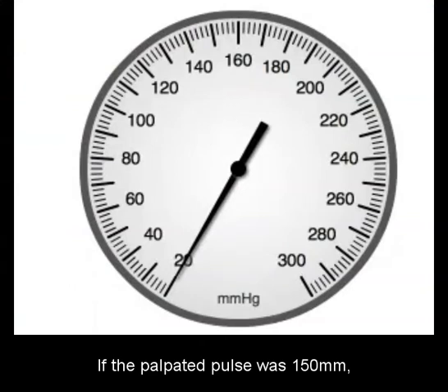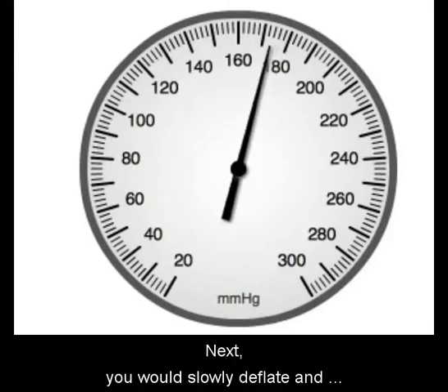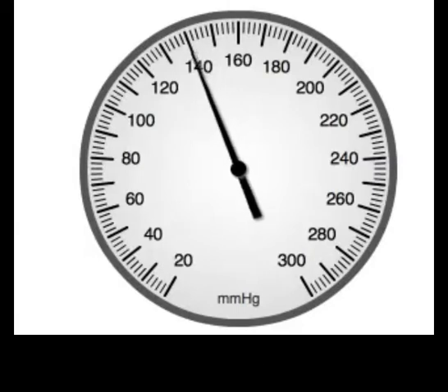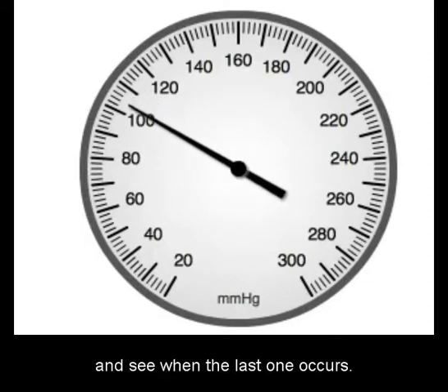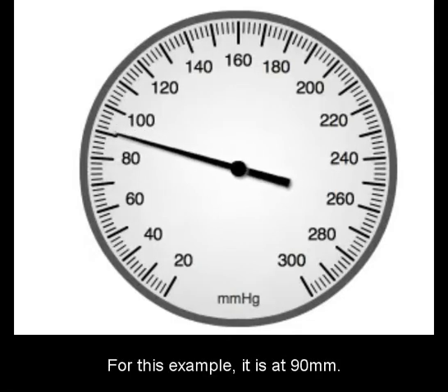If the palpated pulse was 150, you would inflate up to 180. Then slowly deflate and listen for the first bump. It appears that the first bump occurred at 160, meaning this patient's systolic number is 160. You will then listen for the muffled sounds of bumps and see when the last one occurs. For this example, it's at 90.